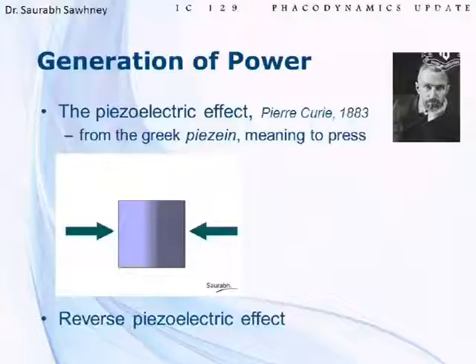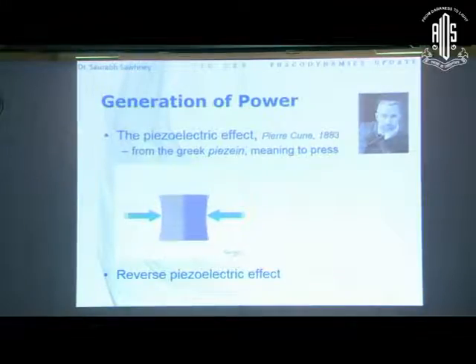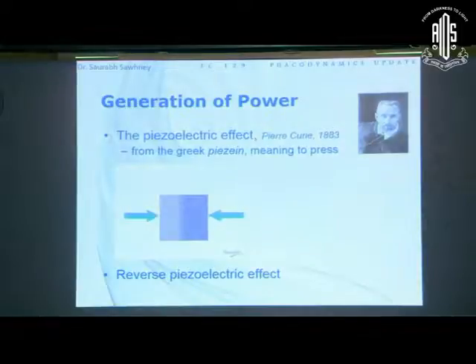In 1883, a gentleman called Pierre Curie described what is called the piezoelectric effect. This effect was that if certain kinds of crystals were pressed physically, they generated an electrical impulse. In phaco, we use what is called the reverse piezoelectric effect. So if certain crystals are given an electrical impulse, they tend to move or vibrate physically. And this principle is used to provide the power to the phacotip.